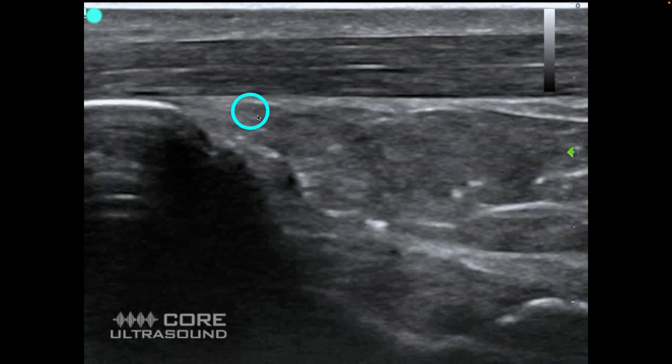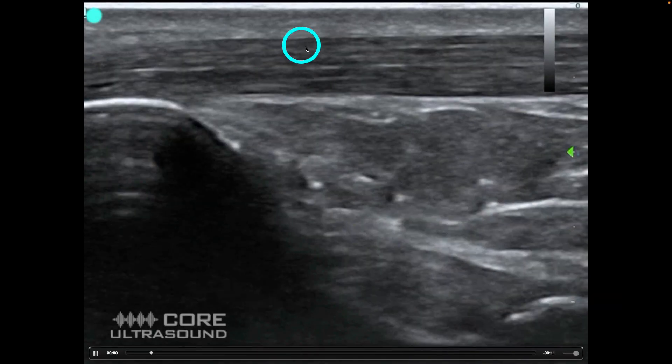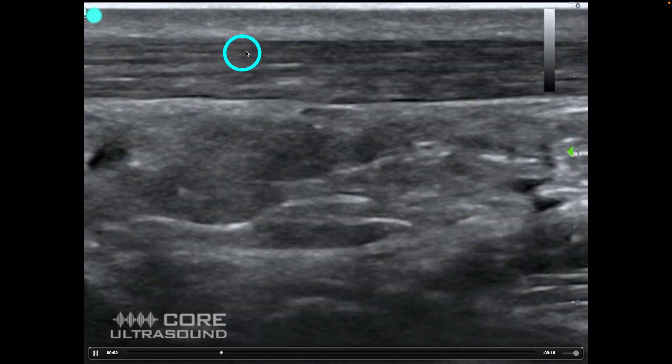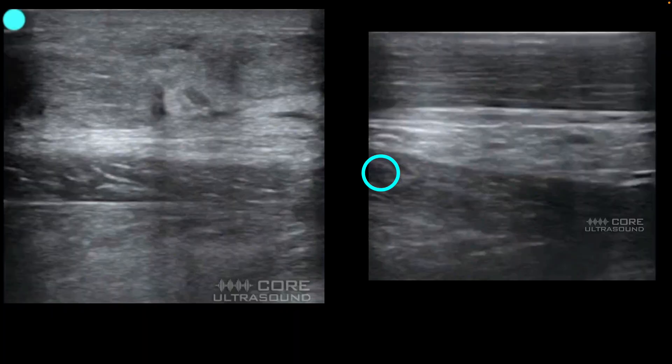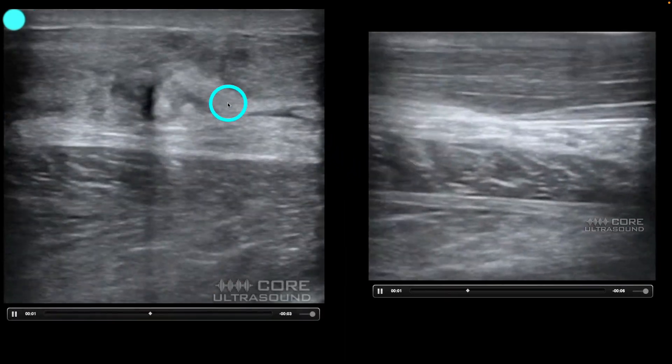This is a perfectly intact Achilles tendon right here. It's nice and straight. There's no big bulgings in it. There's no tears going through it. Let's compare this to what pathology looks like.